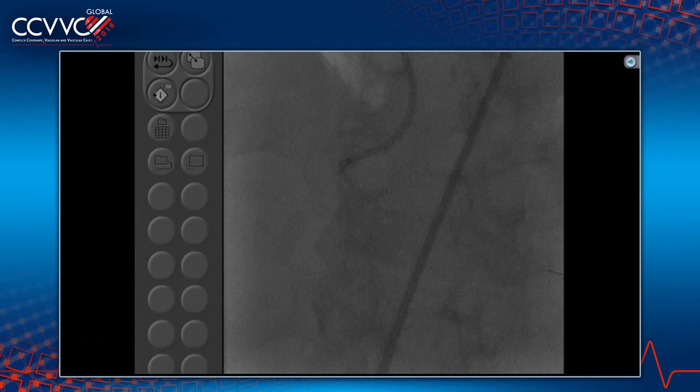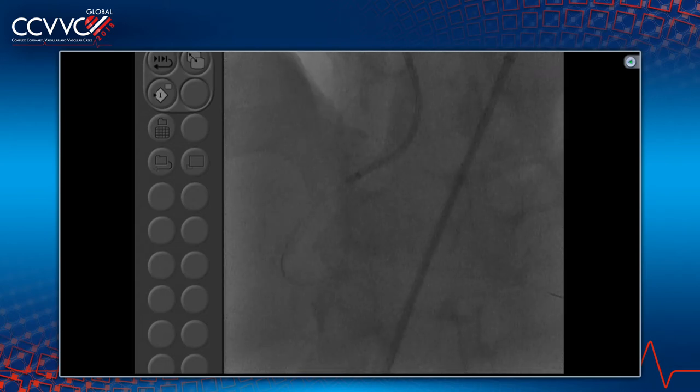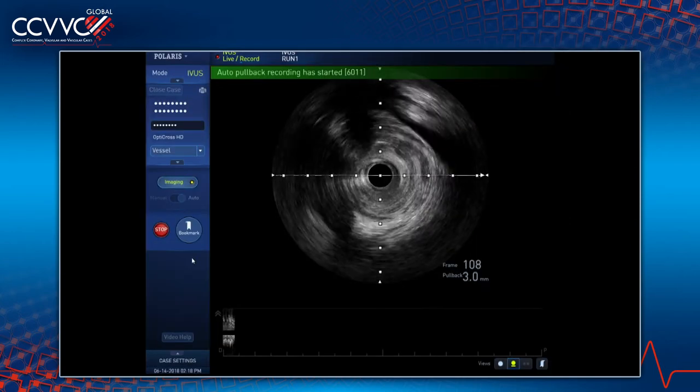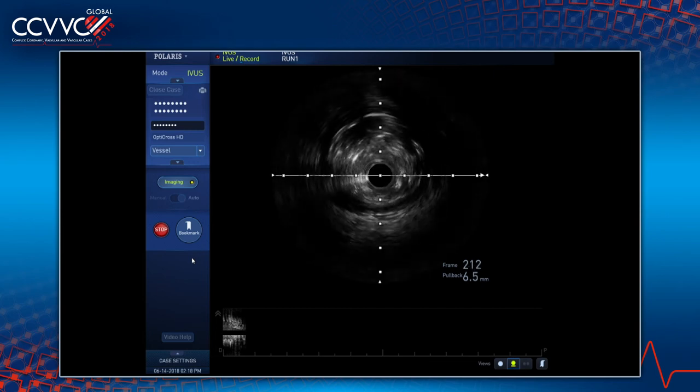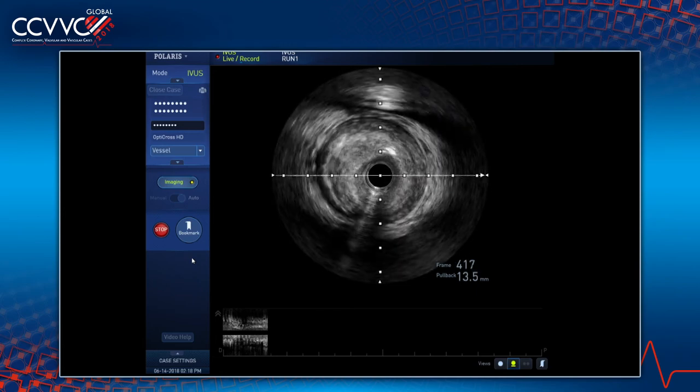Dr. Mehta, any ideas? Well, I can give you a little historical perspective. In the 108 odd CCC live cases, we've had about 35 CTOs, and I think there was only one failure. But the more relevant strategy, which Anu mentioned, is that somewhere around a year ago we moved into using the Gaia earlier, and that has made a big difference. To me, the real take-home message is that in wire escalation, where our strategy used to be more of a Miracle and then a Confianza, moving a little earlier into the Gaia looks very promising.